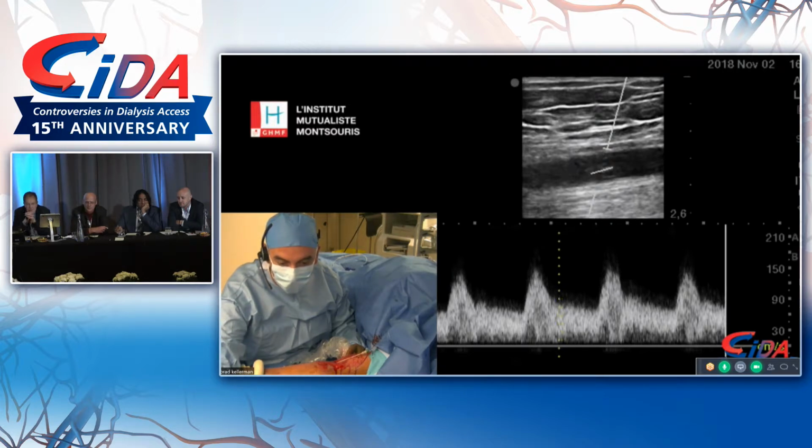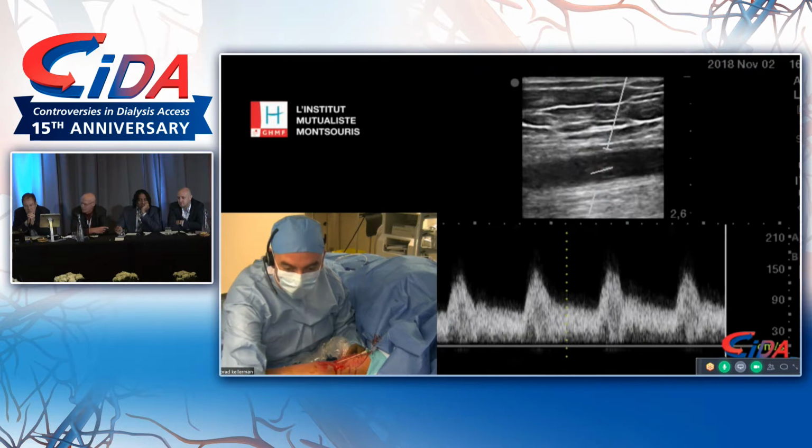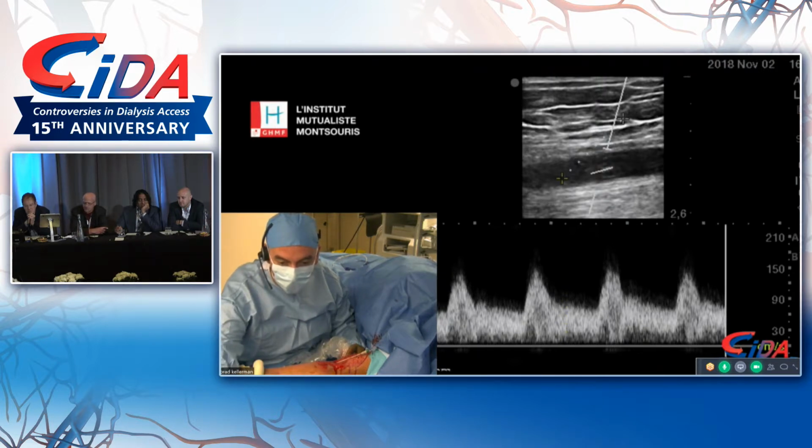He also sort of pioneered the all-in-one maturation. He had balls of steel and just went up there and ballooned that thing. Oh, he's awesome. And didn't worry about it. When we initially used the balloon, we were just treating spasm. There's always recoil and there's always spasm when you put this device in, and we were just trying to affect that. Like I said, Alex took the technique and the overall results to a new level. So thank you, Alex. That was fantastic.